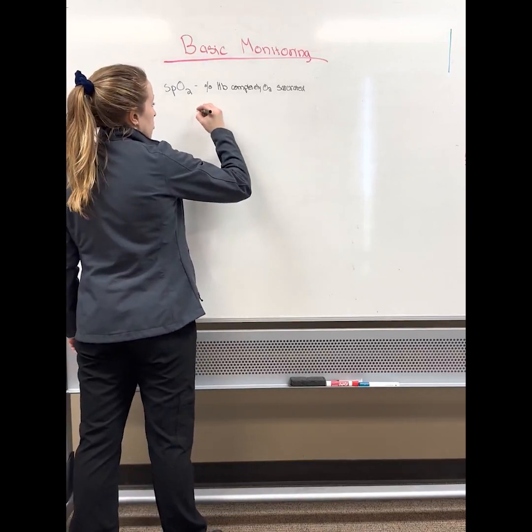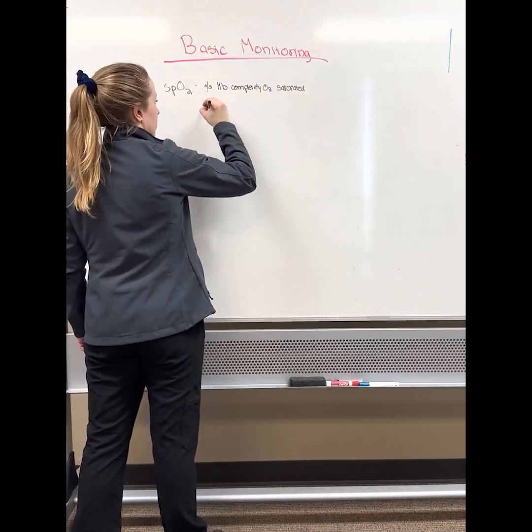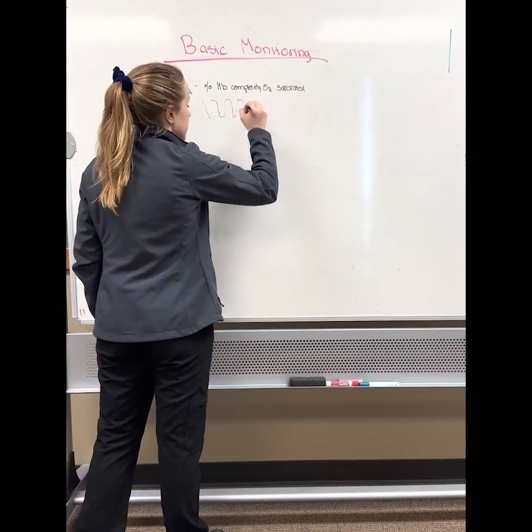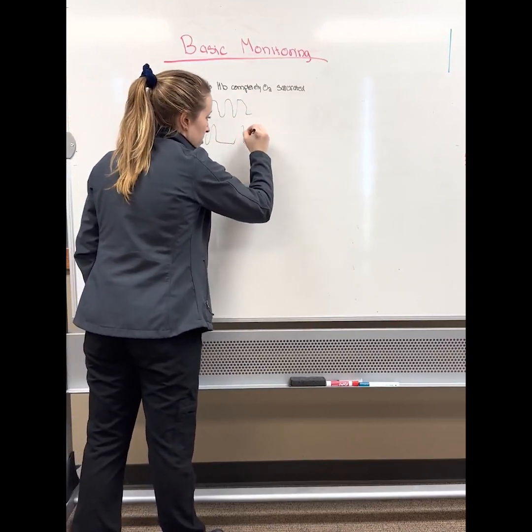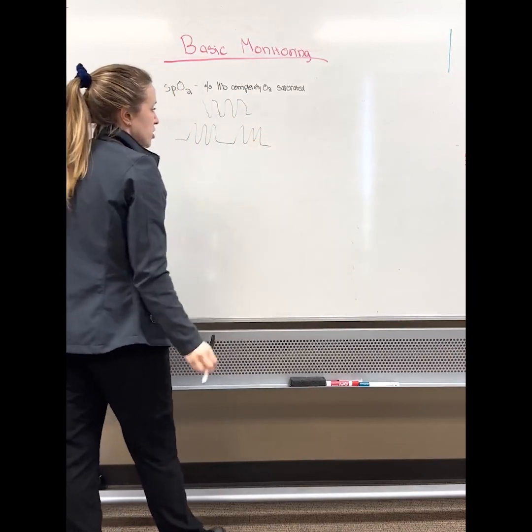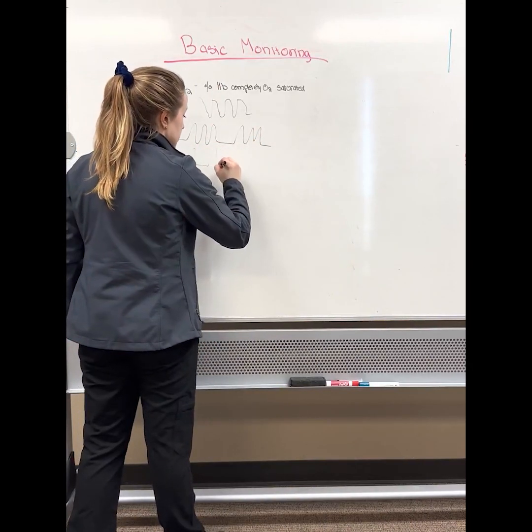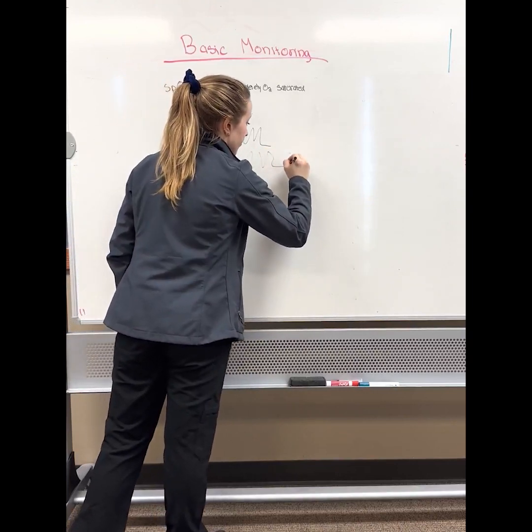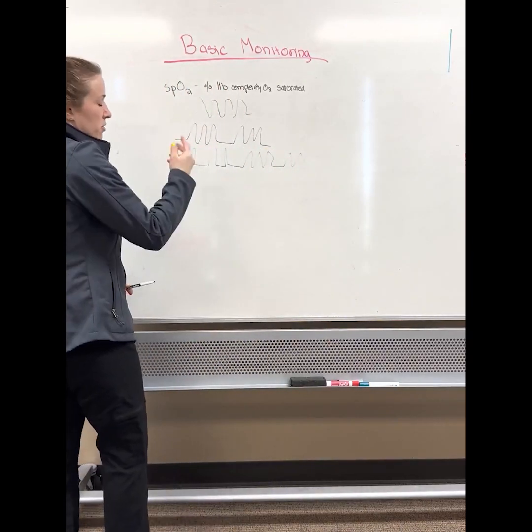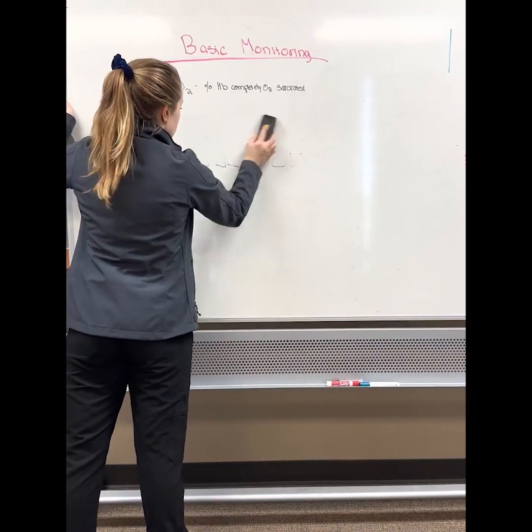So if the rhythm is normal, you're going to see a plethysmograph wave, or a pulse oximeter wave, very regularly like this. And if they have a sinus arrhythmia, maybe they're going to have like 3 or 4 beats and then a pause, right? And if they have other arrhythmias, maybe they have a beat, a pause, another beat quickly, and then a couple more. So the pulse ox can tell you about saturation, but also tells you about rhythm and heart rate, which is kind of useful, right?